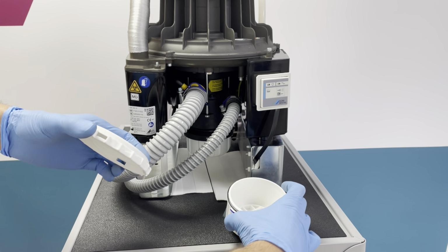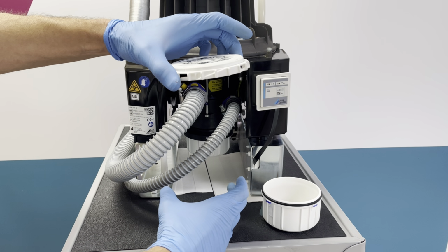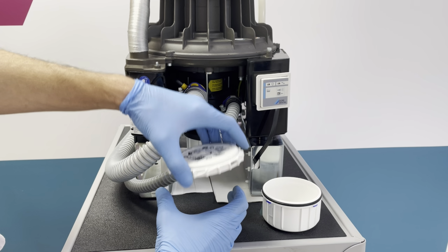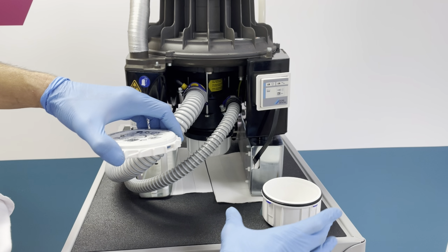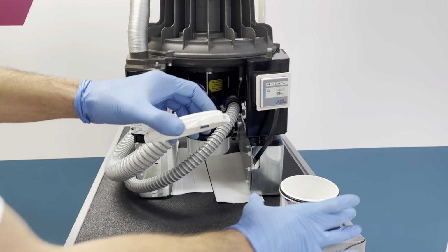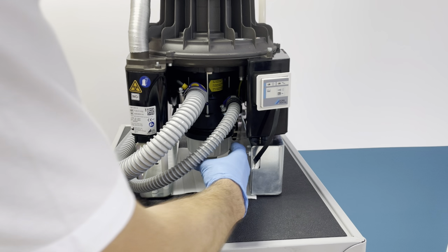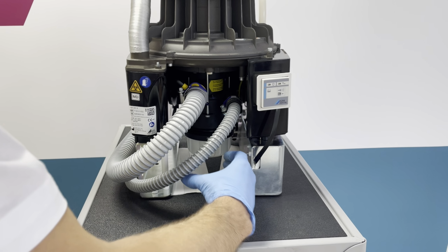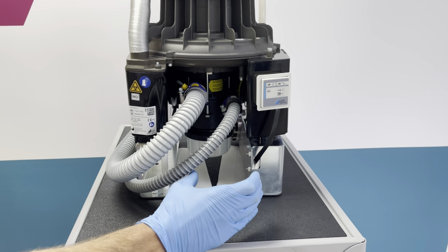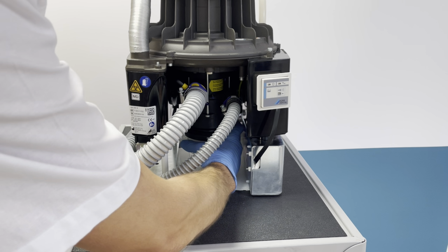So what you need to do is when you take the contaminated pot off, put the lid onto the pot as soon as possible to avoid any risk to yourself. Put that to one side and then put the new pot in. So we'll just put that to one side, get it ready, put it to one side. So the idea is just turn this 1/8 of a turn anti-clockwise. So if you're looking at the machine from the bottom, it'll be 1/8 of a turn anti-clockwise.